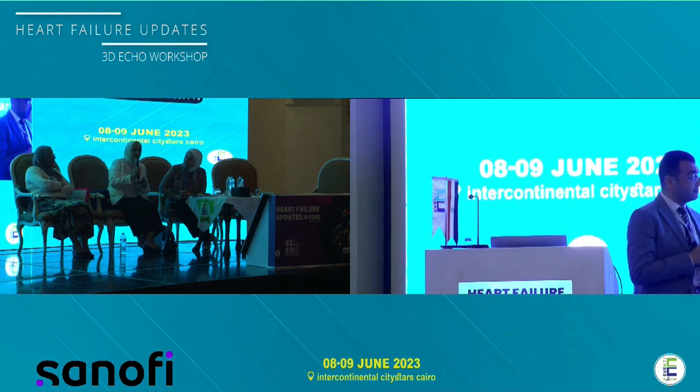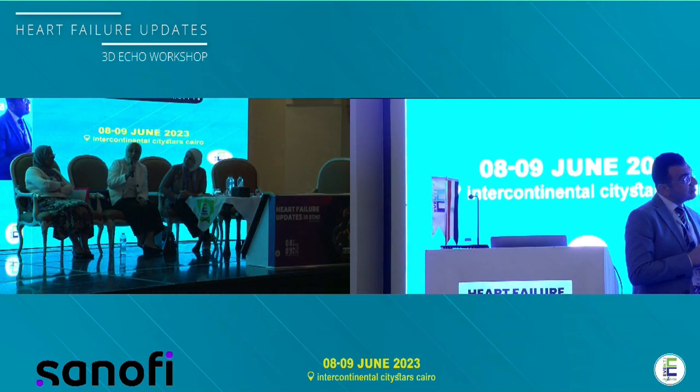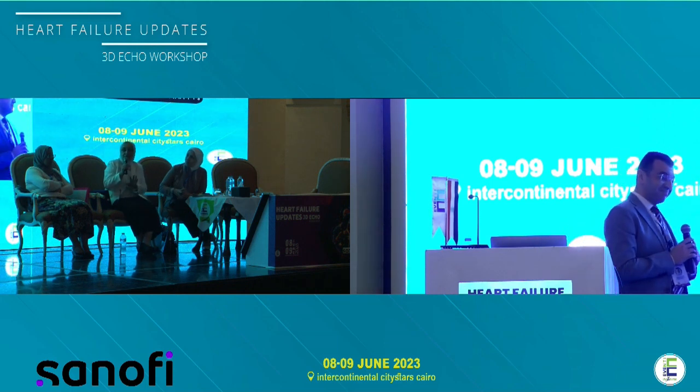Something else I just want to mention: we are just closing the secundum ASD as per the guidelines, but the closure of the sinus venosus defect is coming into practice by stenting, so this is something else to be considered nowadays as well. Yes. Thank you very much. You don't want to say any comments?